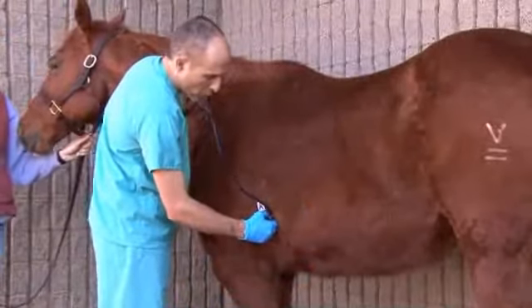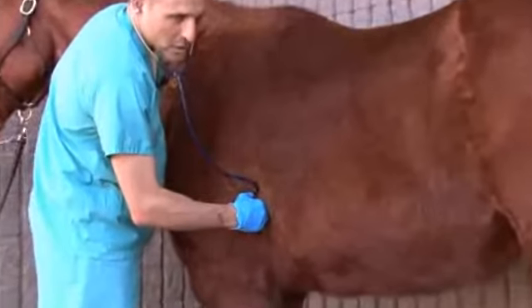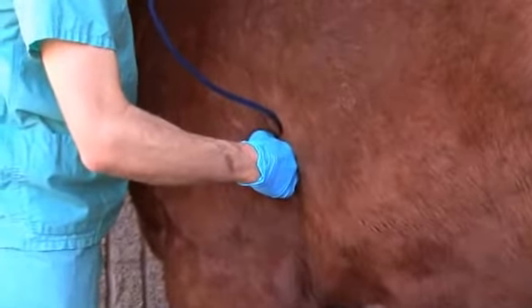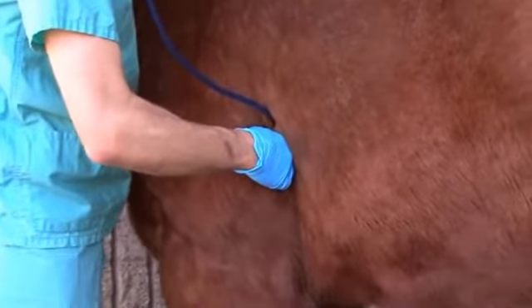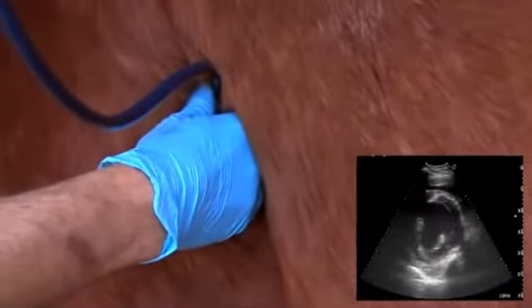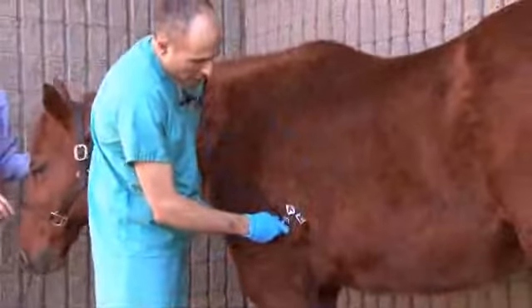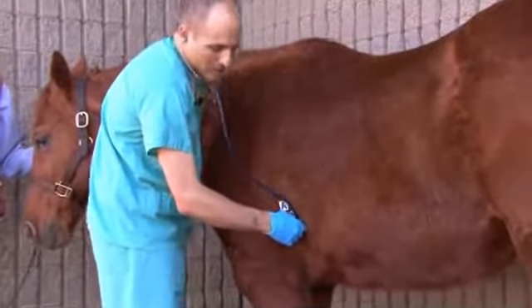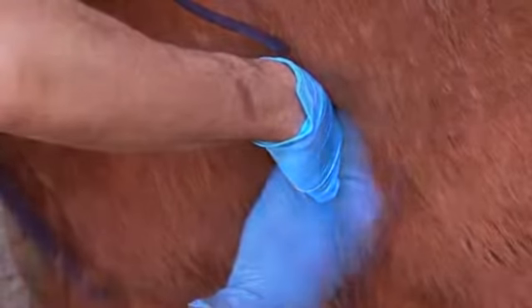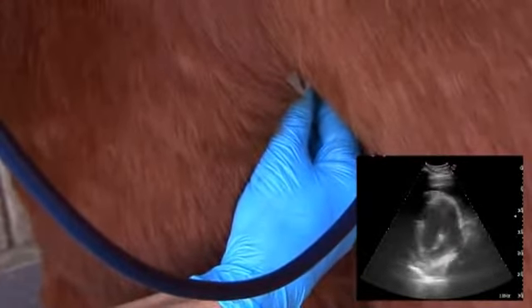To auscult the aortic valve, I'm going to move my stethoscope head forward one rib space and just slightly dorsal or above the mitral level. And you'll notice that I'm pushing the stethoscope head underneath the musculature. Again, I'm hearing lub-dub. And finally, for the pulmonic valve, I'm going to move even further one rib space and lower the stethoscope head slightly. Again, I'm hearing lub-dub.